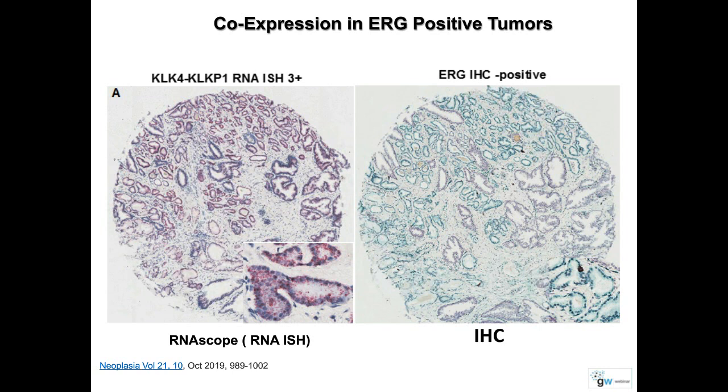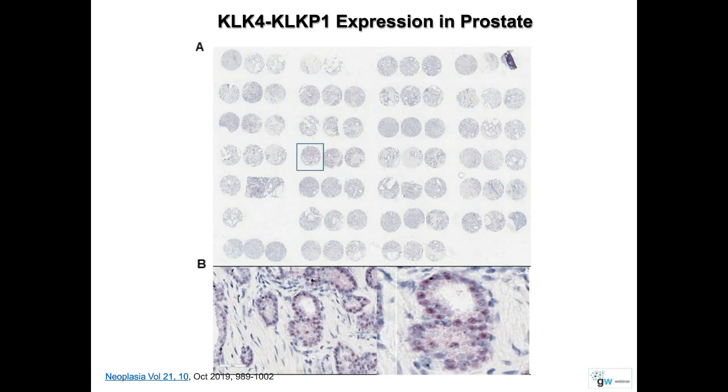The next slide shows that we can screen a large number of cases using tissue microarray. Only the cases that are positive for the expression show the expression, but when the cases are negative, you don't see any signal at all.